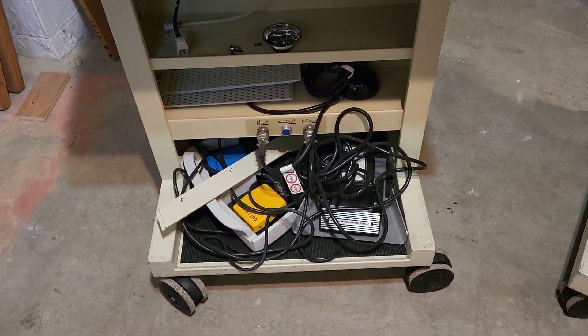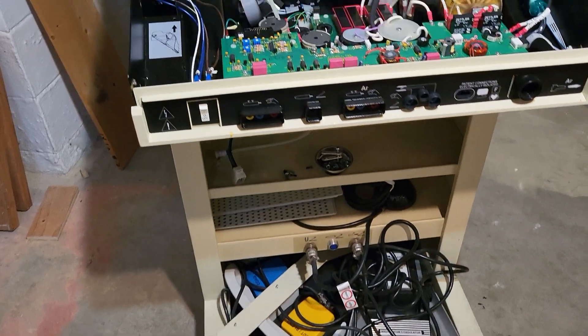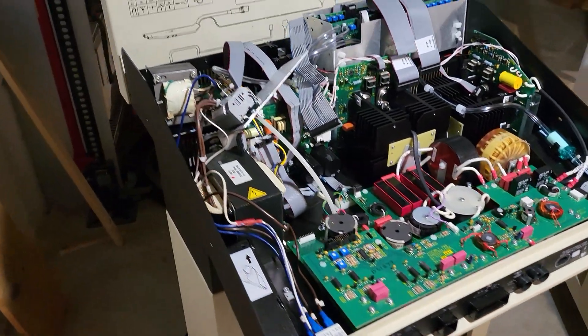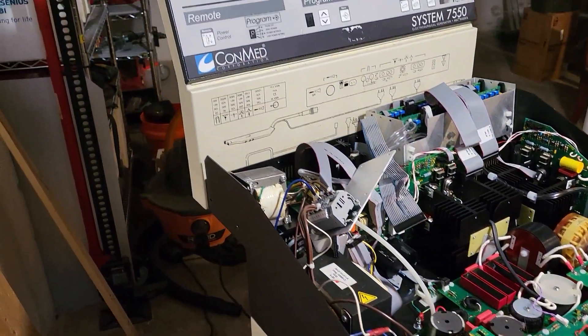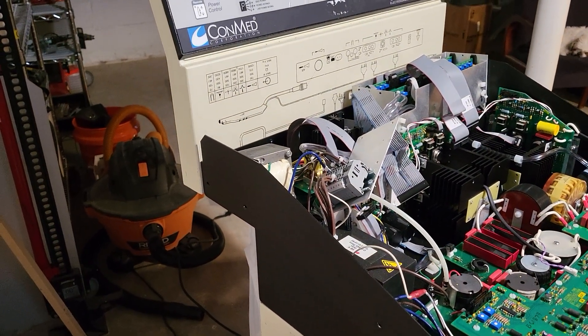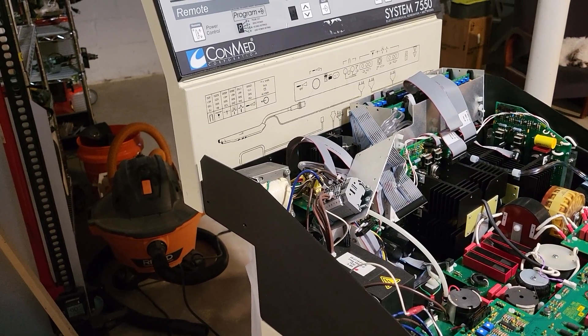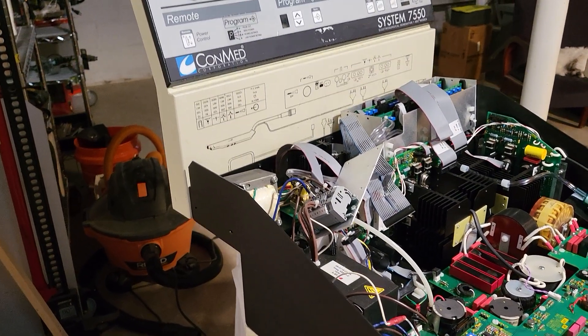And shorten those cables for sure, and all the foot pedals. We're going to need to brace this back panel and put something right there so that it's more stable. There's four screws holding that in right now.